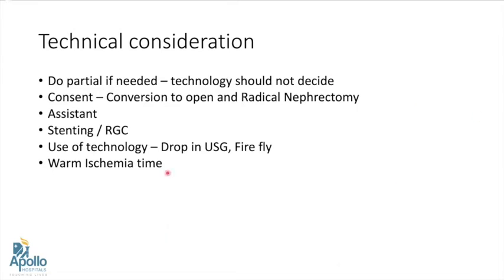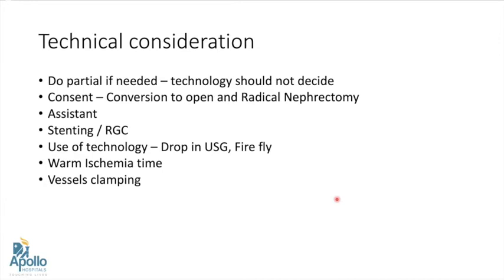Warm ischemia time plays a very important role in partial nephrectomy. However, even if warm ischemia time is increasing, if we can save the nephron by doing a partial, we should always do a partial — but we should always try to shorten the warm ischemia time. For vessel clamping, I clamp only the artery in most cases, except for complex ones where I also clamp the vein, but I remove it very early once the inner layer is done.